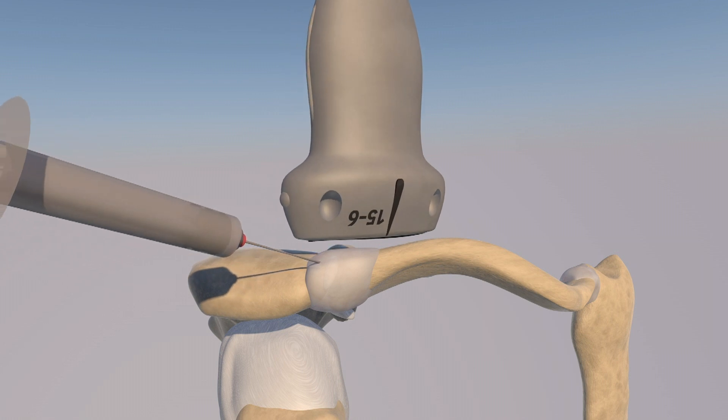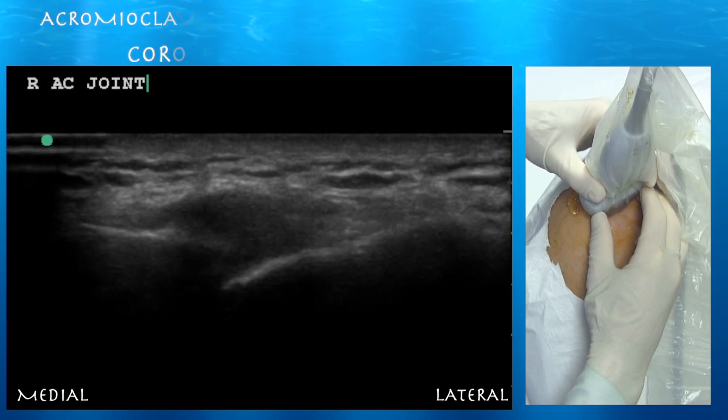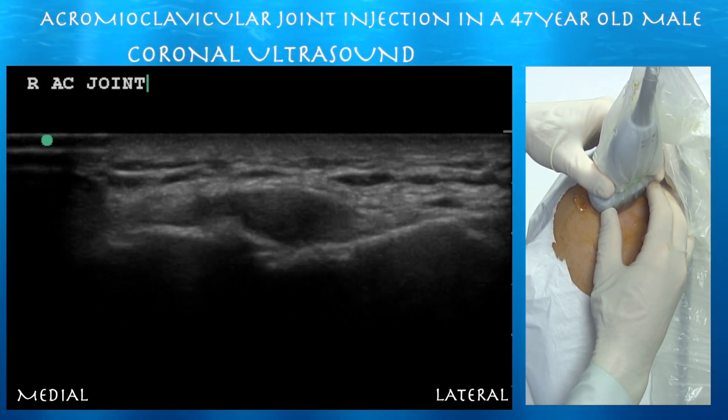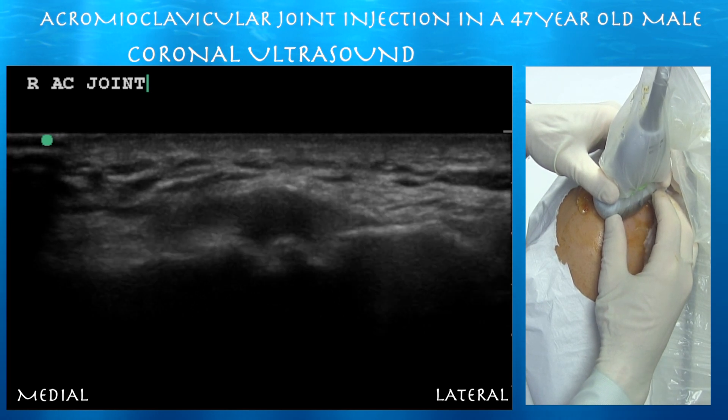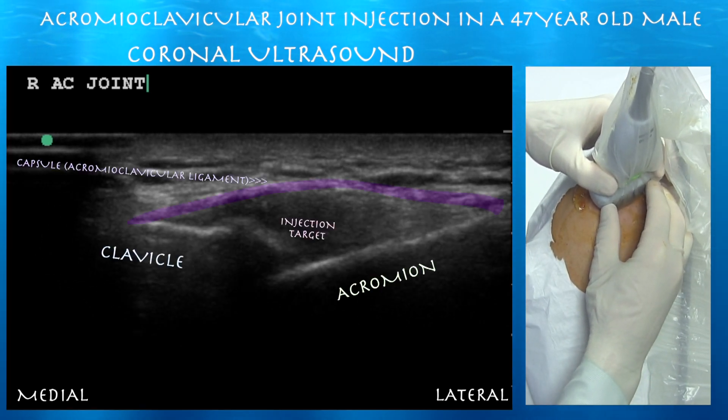Now, during the same procedure, we've rotated the probe and the syringe, and here we are doing an in-plane approach of the acromioclavicular joint. Looking at the acromioclavicular joint, the clavicle is on the left side. You can see the acromioclavicular articulation with the capsule that's distended above the joint.